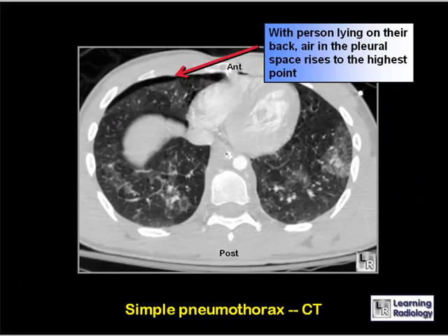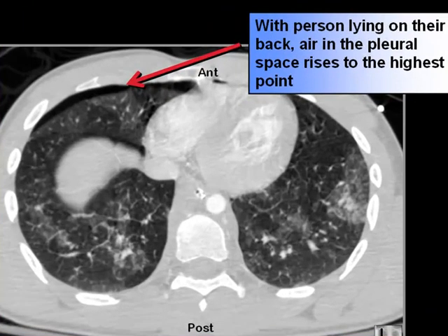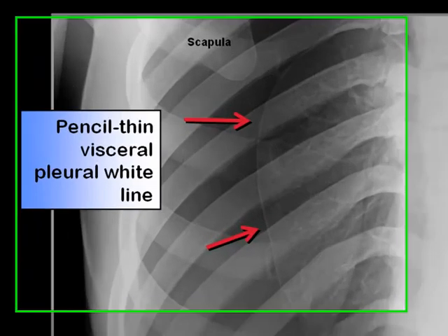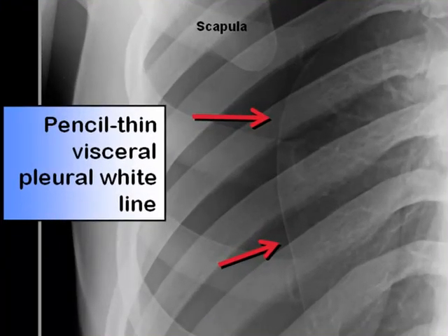This is a CT scan of the chest in a patient with a simple pneumothorax. With the person lying on their back, which is how most CT scans are obtained, air will rise in the pleural space to the highest point — just underneath the anterior chest wall — as evidenced by this black crescent. On conventional radiography, pneumothoraces must demonstrate the pencil-thin visceral pleural white line, which is the visceral pleura separated from the parietal pleura by air in the pleural space.